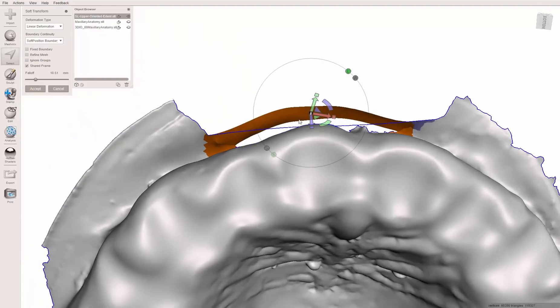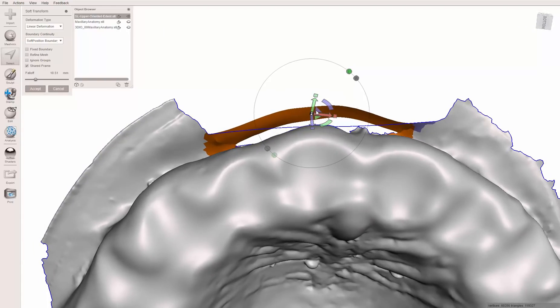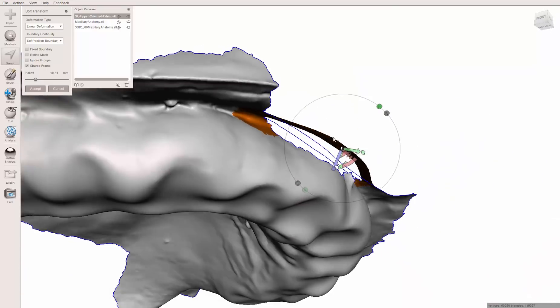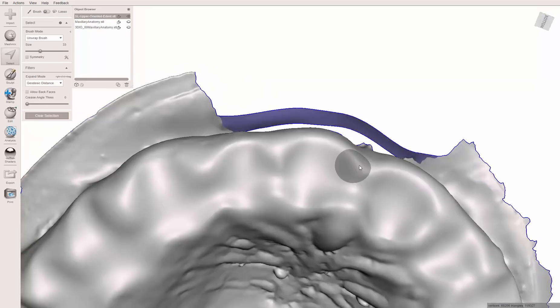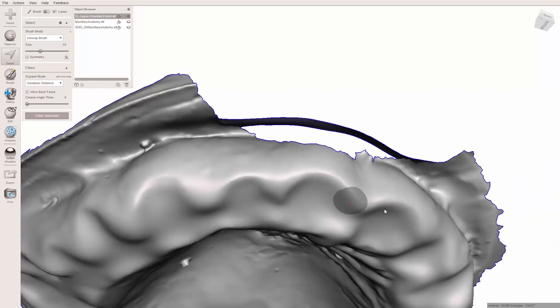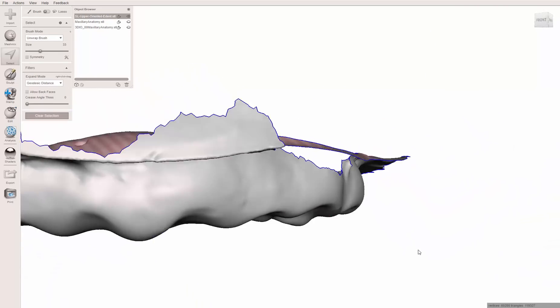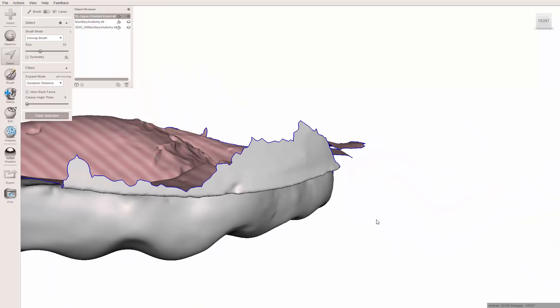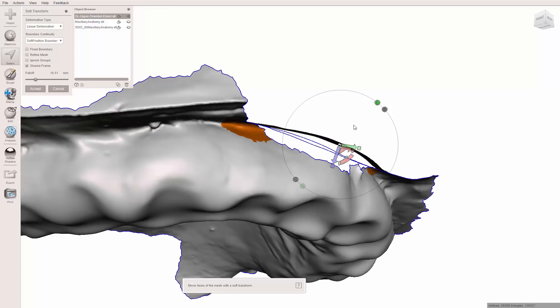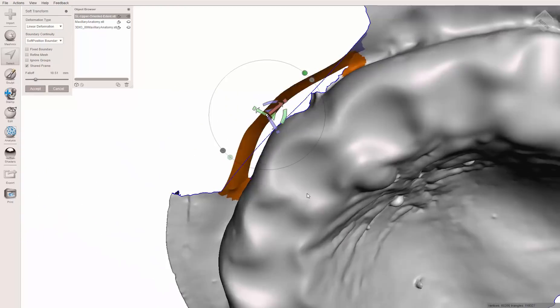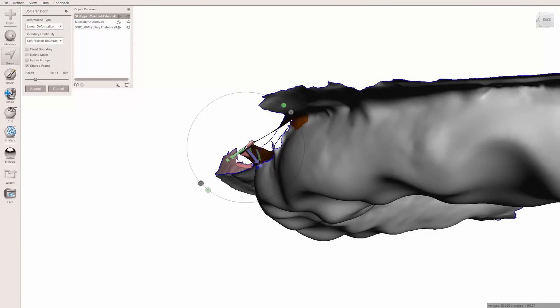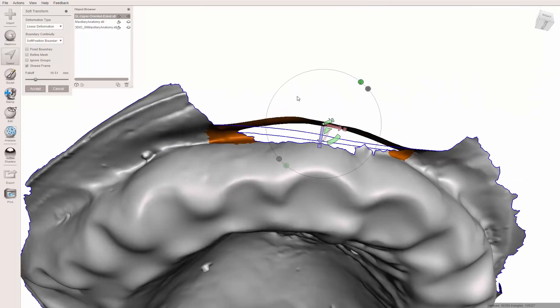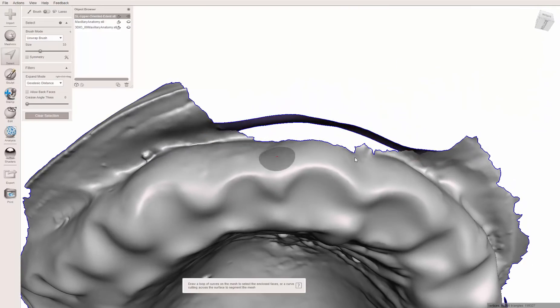And I'm just trying to simulate what the vestibule would seemingly do, how it would bend out. Once I get decent, we're not looking for perfection right here. Just we're trying to develop some sort of vestibule. Hit accept. In fact, control Z, I'm going to bend this down a little bit like the buccal mucosa kind of tipping down. All right. Hit accept.